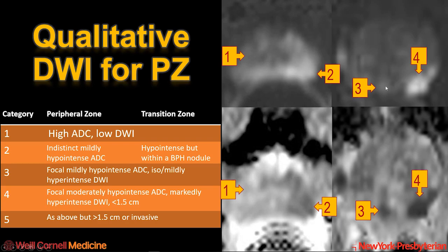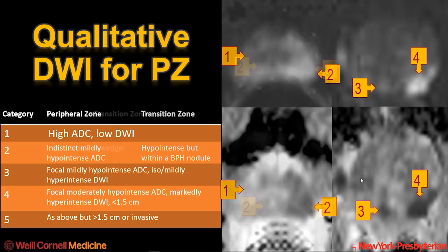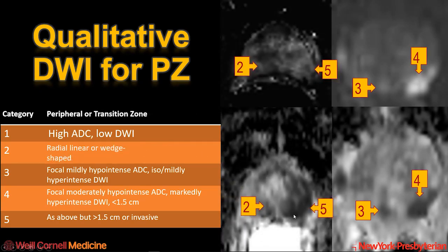If it's not the brightest thing on the high B-value DWI, it would be category 3. The brightest thing on the high B-value DWI and darkest thing on the ADC map is category 4. When it's very large or invasive, that would be category 5. One addition in PIRADS version 2.1 is that a linear structure in the peripheral zone is also category 2.